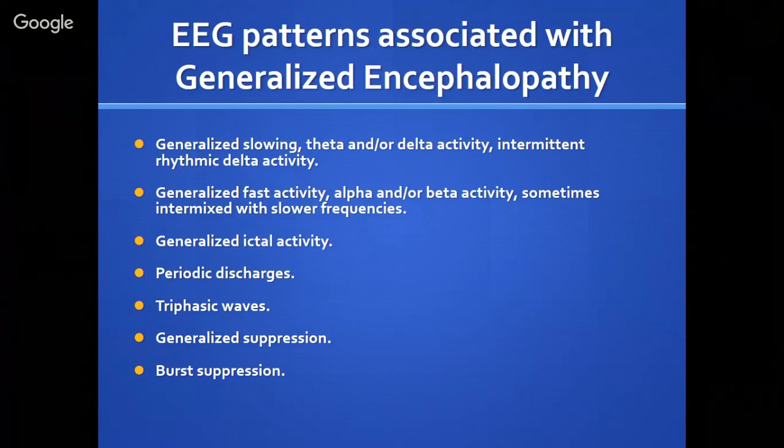All right, so from 0 to less than 4 is delta, from more than 4 to less than 8 is theta, from more than 8 to less than 14 is what? Alpha. And then what does beta go from and to? Like 14 to 20, but then there's beta one and beta two. What does beta two go for? It's almost like 30, and then after that is gamma, right?